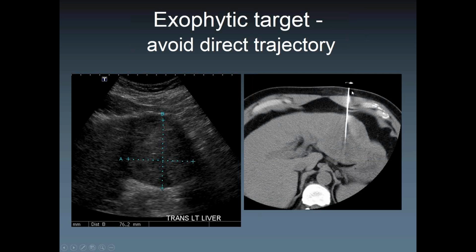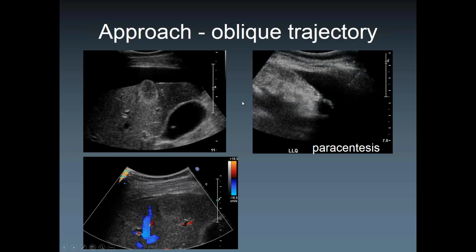So what about here now? The other confounding factor with this patient here, who also likely has Mets, is that you have ascites. So ascites around the liver means that you have no tamponading effect of the abdominal wall after the needle is out, to minimize the risk of bleeding. However, this has been published, a publication with 15,000 liver biopsies, however, not for malignant lesions but for benign biopsies, showing that there is no increased risk for bleeding if you have ascites on board.